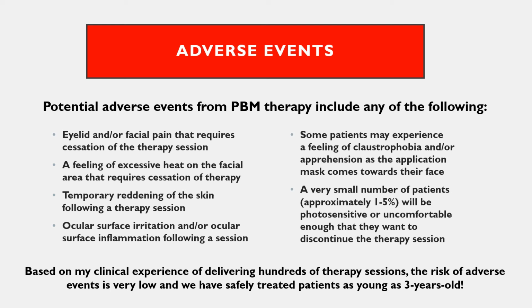I can count them on one hand in 7 months, the patients where we put the mask on and they say, "Dr. Thomas, I don't like this, take it off." "Dr. Thomas, this thing's too hot, it's bothering me, take it off." "Dr. Thomas, I'm not comfortable, take this thing off." Maybe two people in 7 months said that, maybe three. I'm not there every day, but I can count them on one hand. So again, that's an adverse event ratio that I can live with.